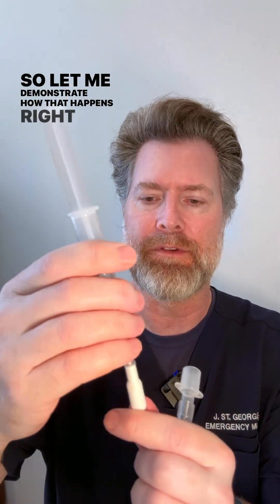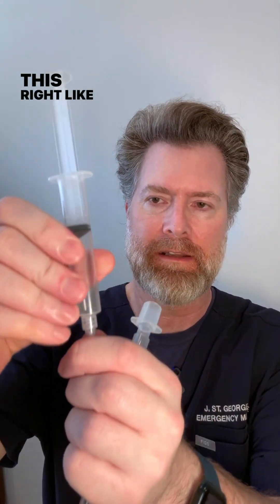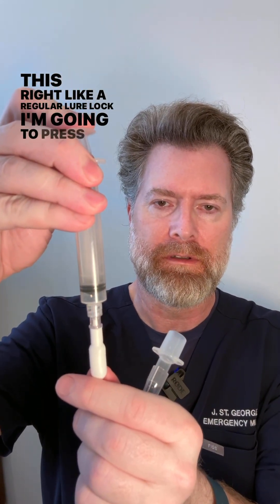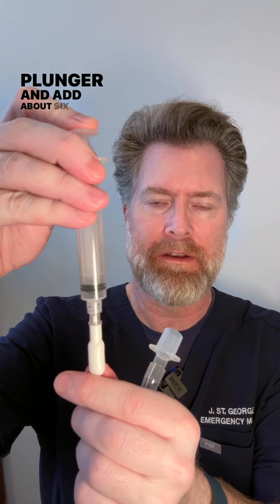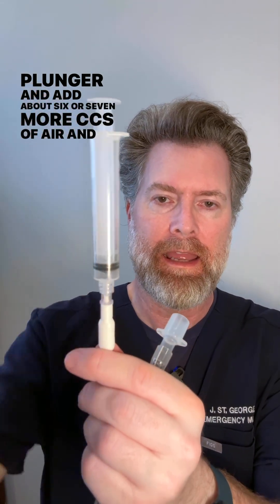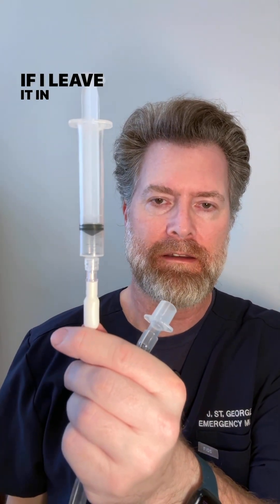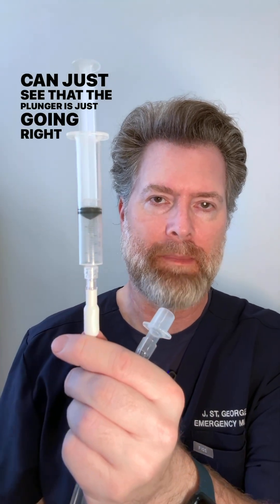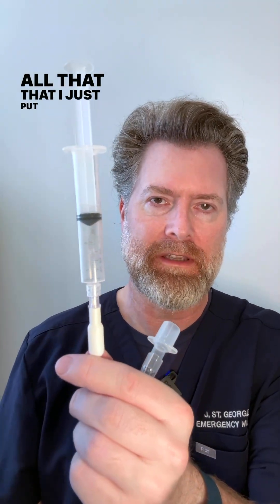Let me demonstrate how that happens. I attach the syringe like a regular luer lock, press the plunger and add about six or seven more cc's of air — and then if I leave it in, see that valve is still open. You can see the plunger is just going right back up, and all that air I just put in is coming back out.